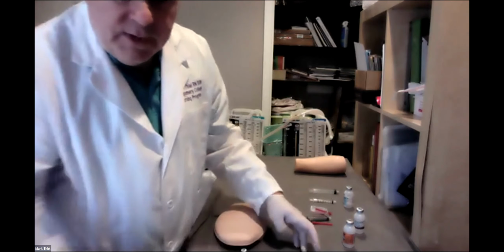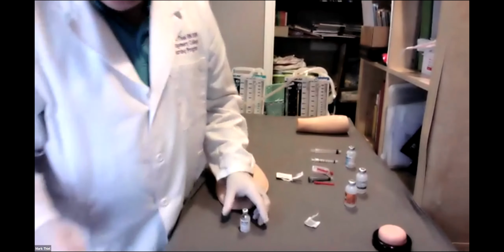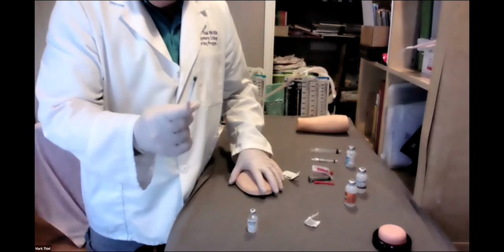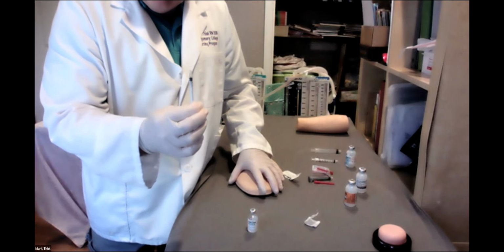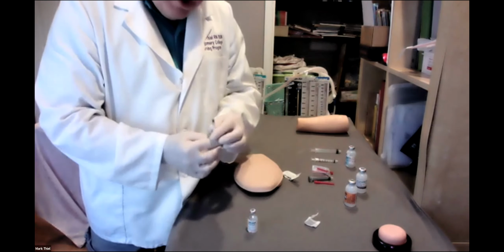Obviously, we scrub the hub. What do we do? Vial is down. Pre-draw the air, which honestly will be tiny in an insulin amount of units, very small ordinarily, but still draw your air.